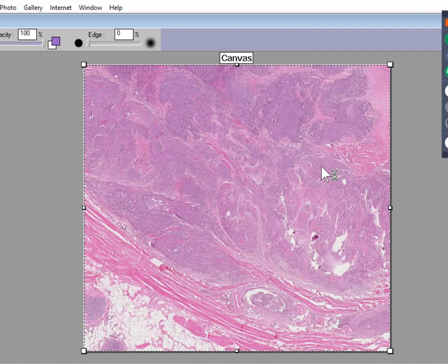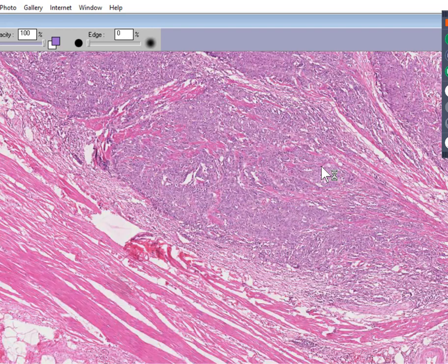Well, you can see the tumor clusters and you can see some connective tissue. But look, at the bottom in the south and in the southwest, you could see what looks like it might be another type of tissue. So let's zoom in on this pinker tissue here. And you could say, yes, whereas this is tumor, this is tumor, this is tumor.